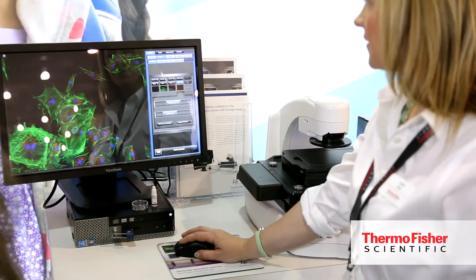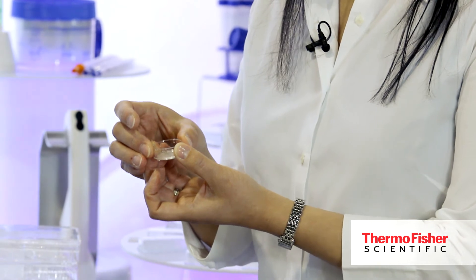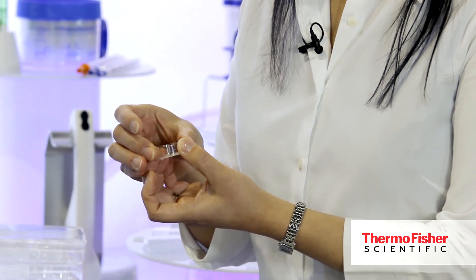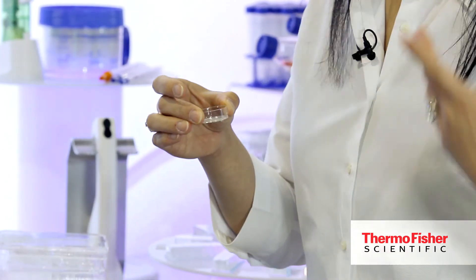This neat device is called the cell culture insert, and they are designed specifically for tumor invasion and migration studies. These membranes are porous, which allows the tumors to pass through to the other side — that's how scientists evaluate cancer metastasis in their studies.